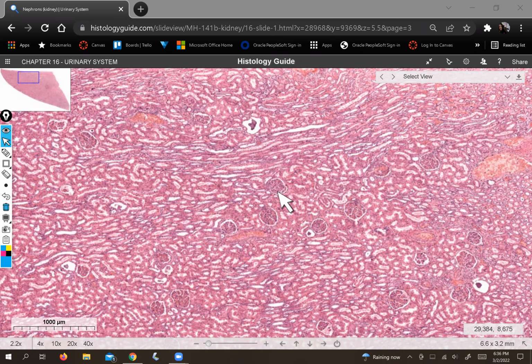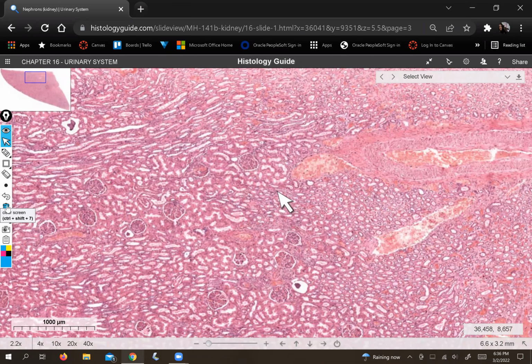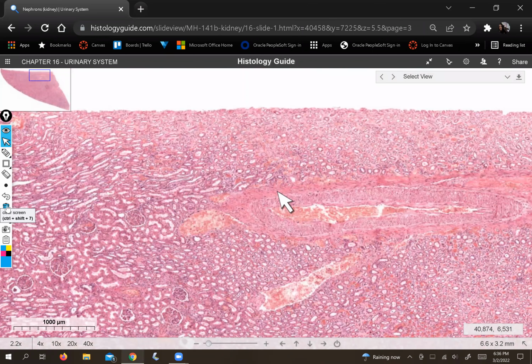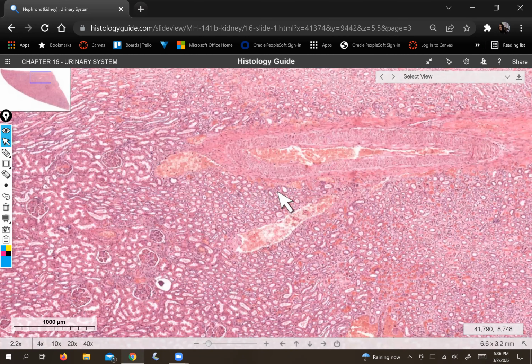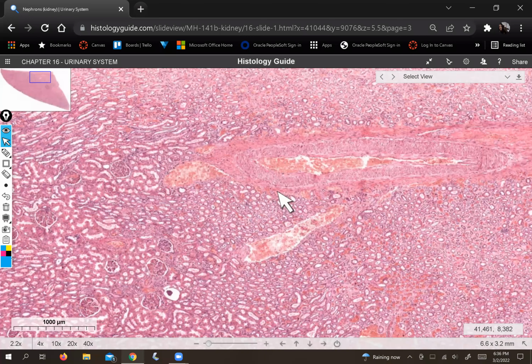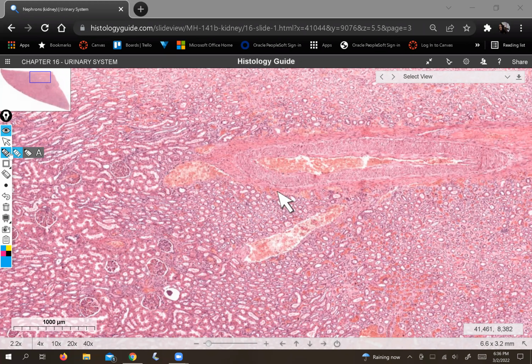And then if we move over a little bit, this is not my favorite view of the medulla that I've ever seen, because it's more cross-sectional, which makes your lives harder. But you definitely can see that, right about where this blue line is, there's a transition from places where you see corpuscles and fuzzy tubes and different organization, and now we're over here in weird cross-section land.